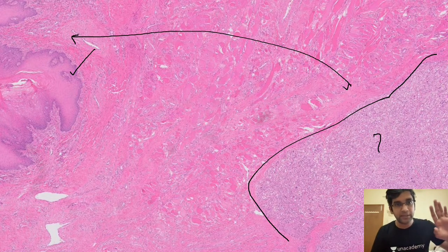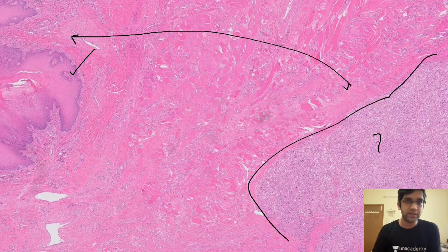So I'm having a completely normal epithelium, at least I hope so in the image. I'm having a completely kind of defined lesion in the dermis, right? With this image, I might probably rule out all the epithelial malignancies because the squamous epithelium looks good. So it's unlikely to be a squamous cell carcinoma or a melanoma of the foot because it's way down, right? And it's way down. So my first possibility here is sarcoma or a hematolymphoid malignancy based on this image, right? It might change when I go to the higher power, right? So on scanner view, this would be my differential diagnosis, right?